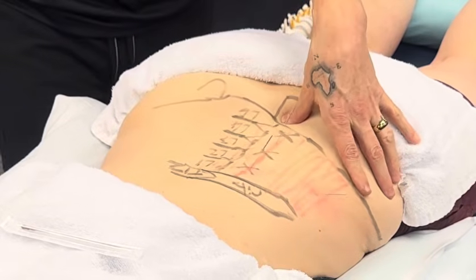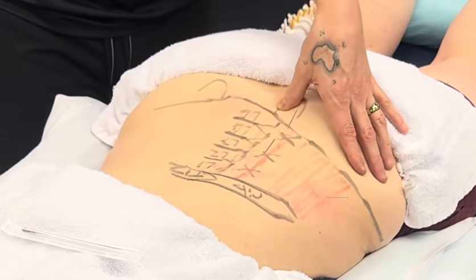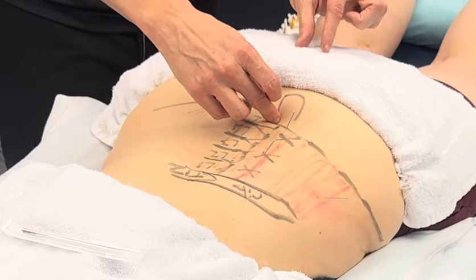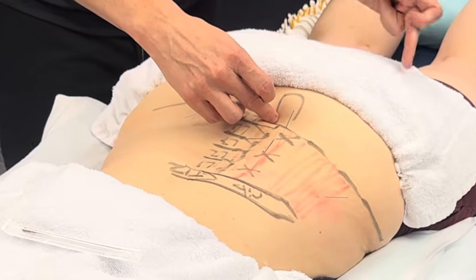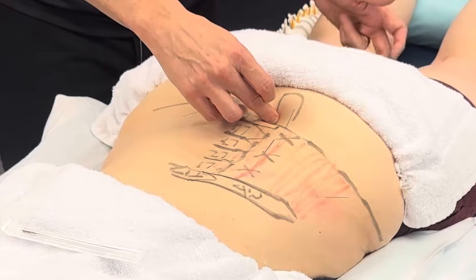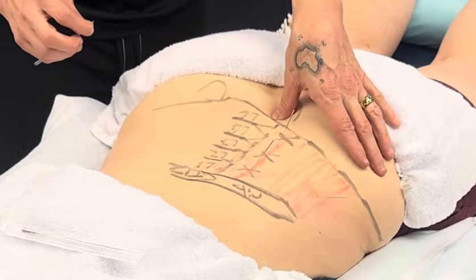So from the PSIS, just inside of that is going to be your SI joint, your SI ligament. This ligament is called the long dorsal ligament. And then we have the sacrospinous ligament, and then the sacrotuberous ligament. I don't usually needle the last two. I usually just needle this one, if I do needle it.